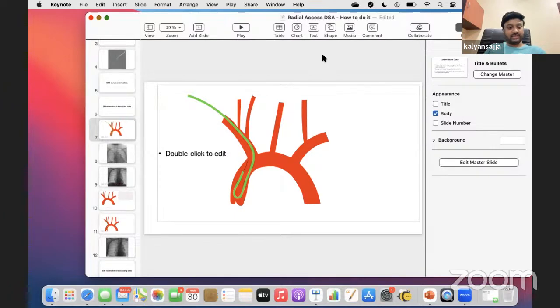And I was a little bit annoyed with my staff: why didn't you guys order this before the case? I should have checked it. Always check the material before you start, right? But it didn't go, and then we had to use a cardiac wire, and it went fine. In the past, we did a few more covered stents, and for all those cases, I think BMW and Chikai Black worked just fine. It's just that this lady was like 85 years old and had very tortuous anatomy. I think I posted that on the group. Very tortuous anatomy. Went through radial.